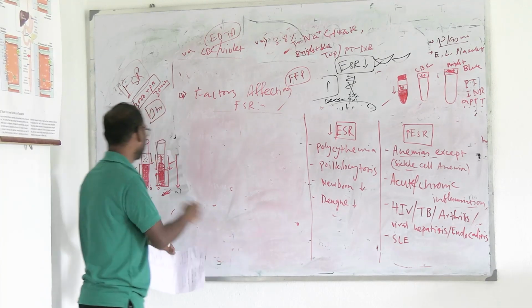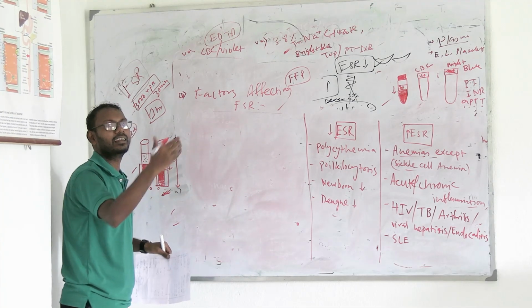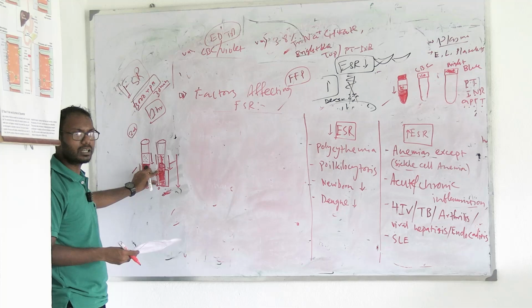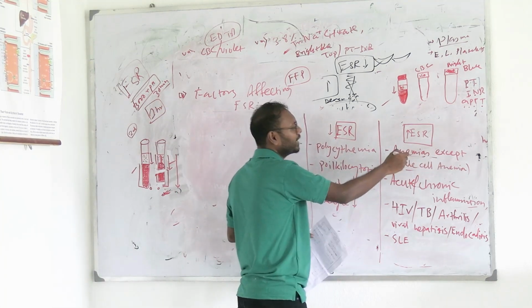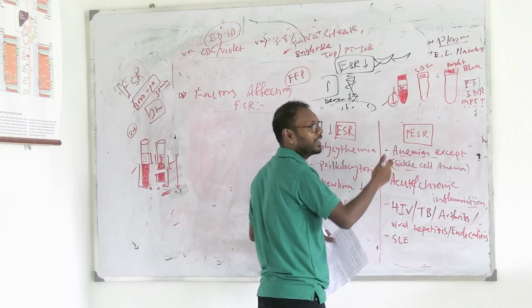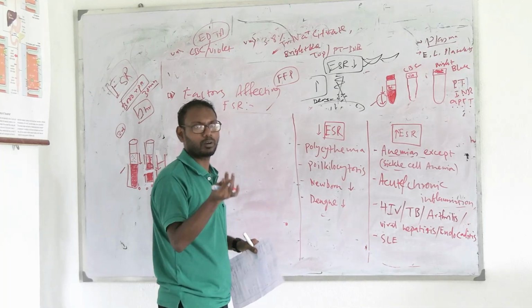একটা জিনিস important, since PCV is below and ESR is higher, in a lot of cases when there is higher ESR there will be lesser PCV, তাই তো? In some cases when the ESR will be higher the PCV will be lower because the volume is less. When there is anemia, the volume of erythrocytes is very much less, so the packed cell volume will be less but sedimentation rate will be higher because you need less cells to precipitate. So in some cases you can say ESR and PCV are inversely proportional, right?